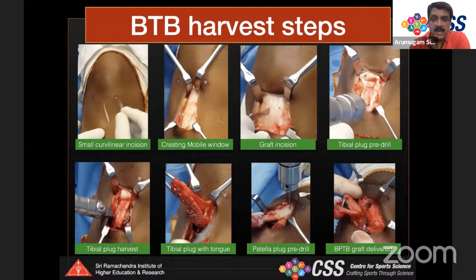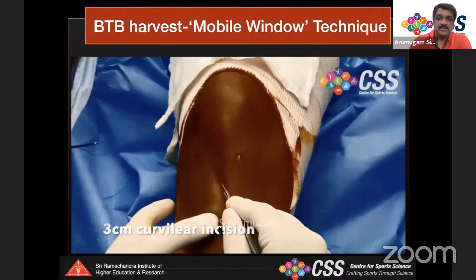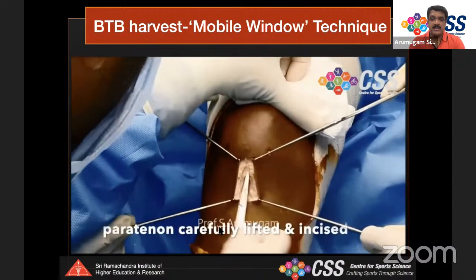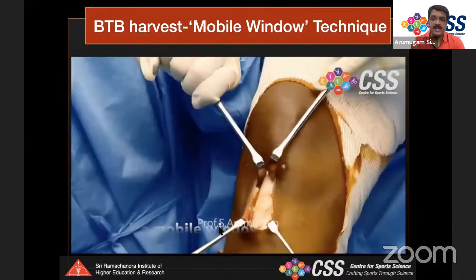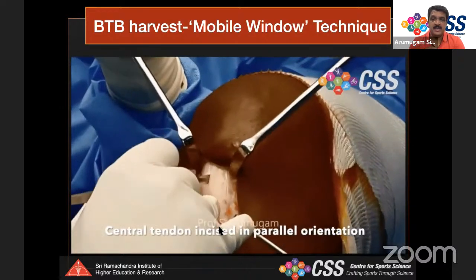Use a small five-millimeter saw blade, never a bigger one. The angle of the saw blade is important — never 90 degrees. Harvest the tibial plug with a tongue shape, which is critical to prevent graft-tunnel length mismatch. After harvesting the tibial plug, extend the knee fully, place the mobile window over the patella, pre-drill the patellar bone plug, retract soft tissue, and harvest the patellar bone plug.